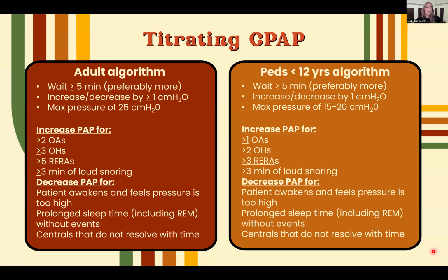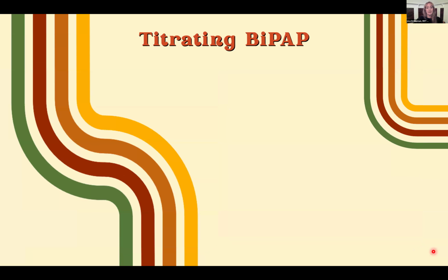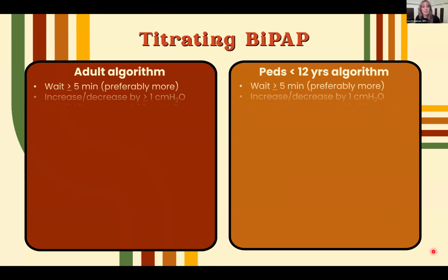If they have a long time without events, you can try to creep it down a little bit, but you want to make sure you're capturing REM if you're creeping it down. And we also usually bring it down if they're having centrals that are not resolved.